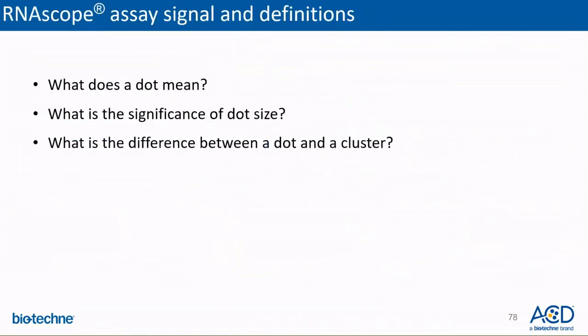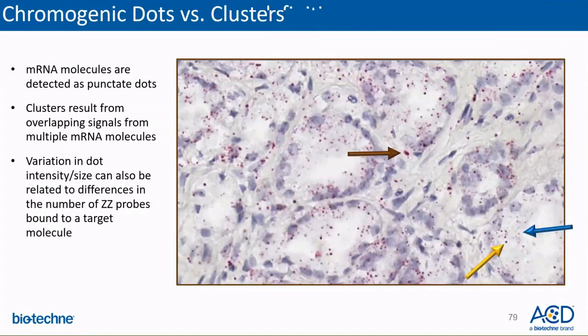Some questions that you may have at this point are, what does a dot mean? What is the significance of a dot size? And what is the difference between a dot and a cluster? In this image, where an RNAscope chromogenic red assay has been performed, the signal appears as numerous punctate red dots of various sizes and intensities, and also a few clusters. It is the number of dots and clusters that are important rather than the size of the dot or the intensity of the dot. Each punctate dot, as shown by the blue arrow, represents one mRNA molecule.